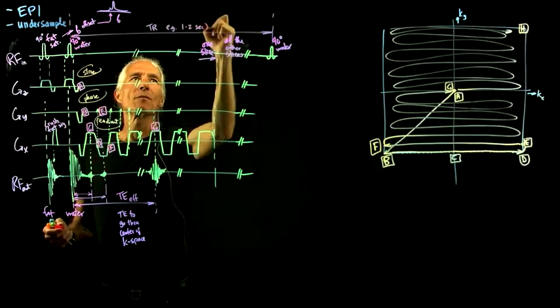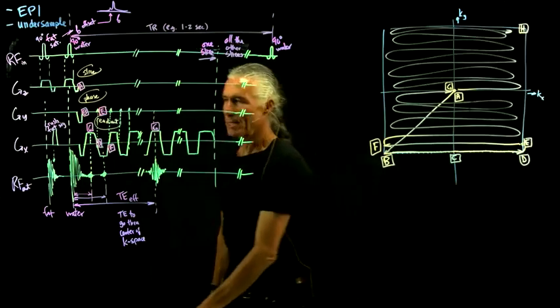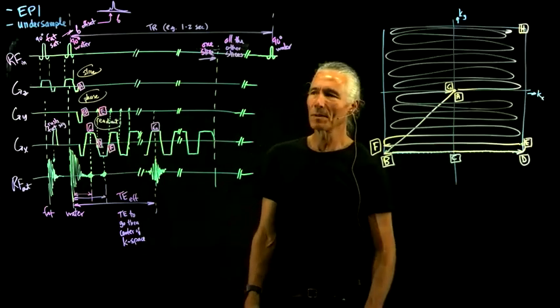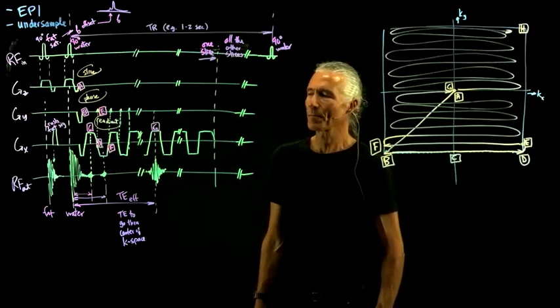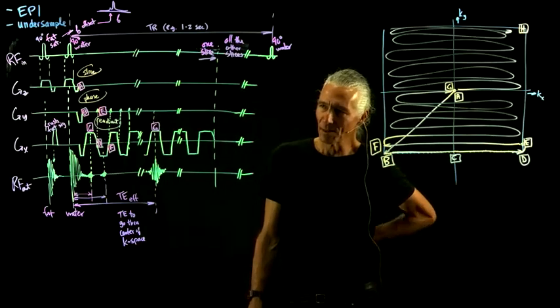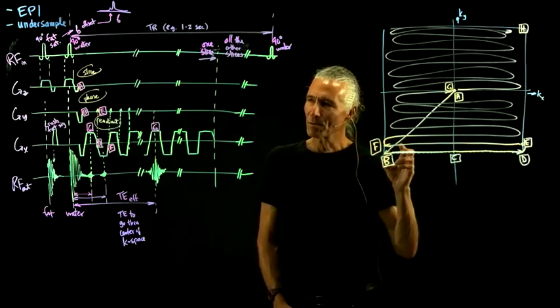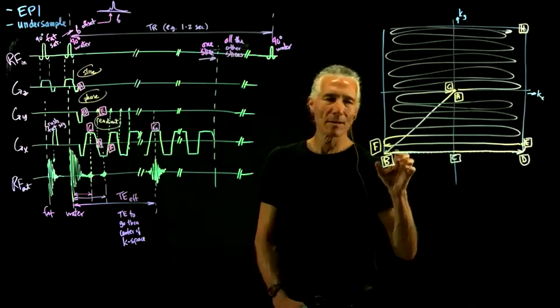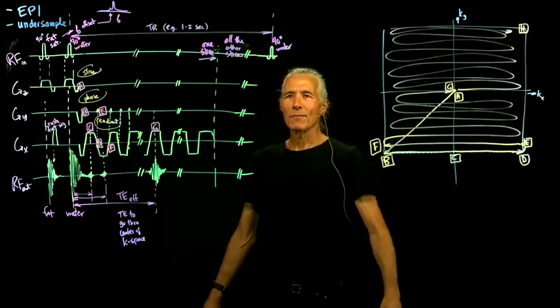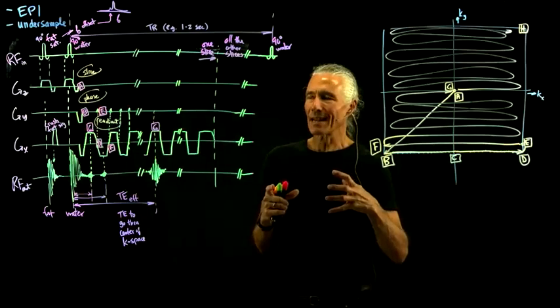So this means that we can record like 15 or 20 slices per second, so we can essentially image the whole volume of the brain every second or two. It's a kind of sloppy imaging technique because there are a lot of distortions in it. We'll try to explain why those distortions are there. It's a little complicated story, so I'll do that next week. But the great advantage is that we can collect a whole volume of the brain in 1 second.